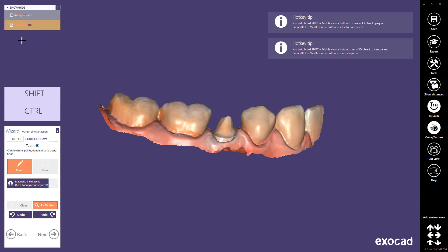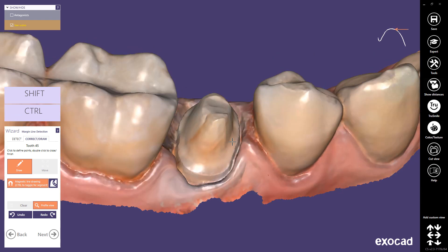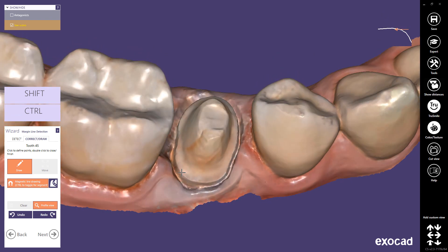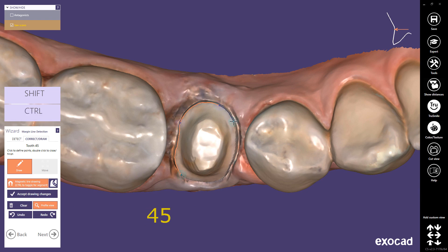To start the design, click to define points of the margin line in the Correct and Draw tab. The wizard will prompt you to click on the margin for a specific die or tooth — it is important to start with the tooth displayed in the wizard. By choosing the magnetic line drawing, detection of the margin will be semi-automatic. Add new points by mouse left click. If the magnetic line drawing option is activated, you can toggle between free drawing and magnetic drawing by holding the Control key.